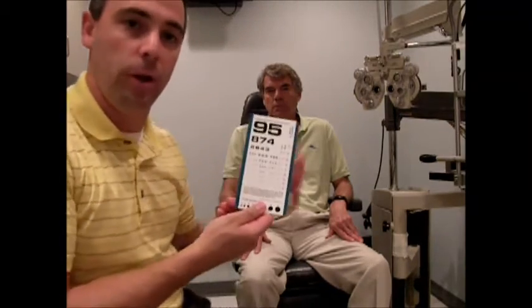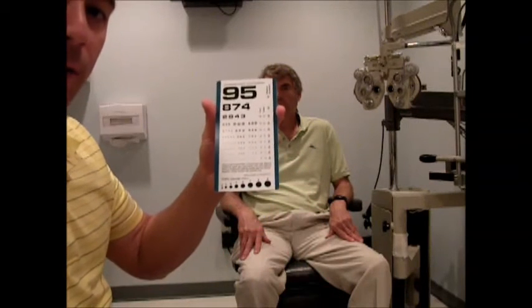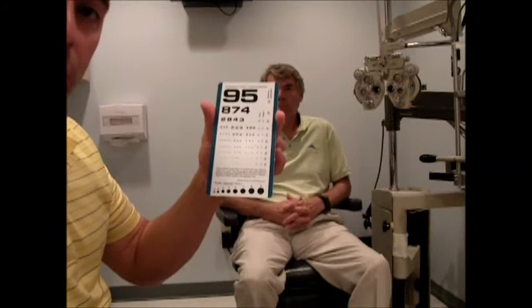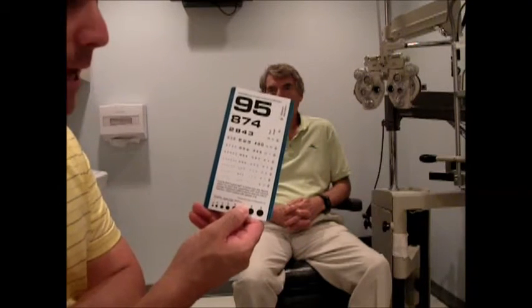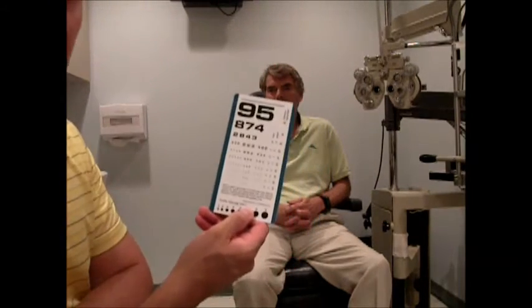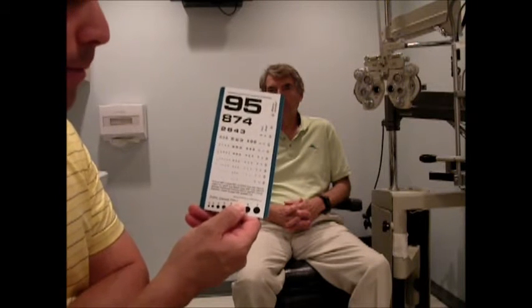Here is an eye chart for close vision. They can read down and there will be numbers on the side showing how far down they've read and what their visual acuity is. 20/40 or better up close means they probably won't need glasses. If anybody is 20/40 distance and 20/40 close, you can give them sunglasses for eye protection or they may not need any glasses at all.